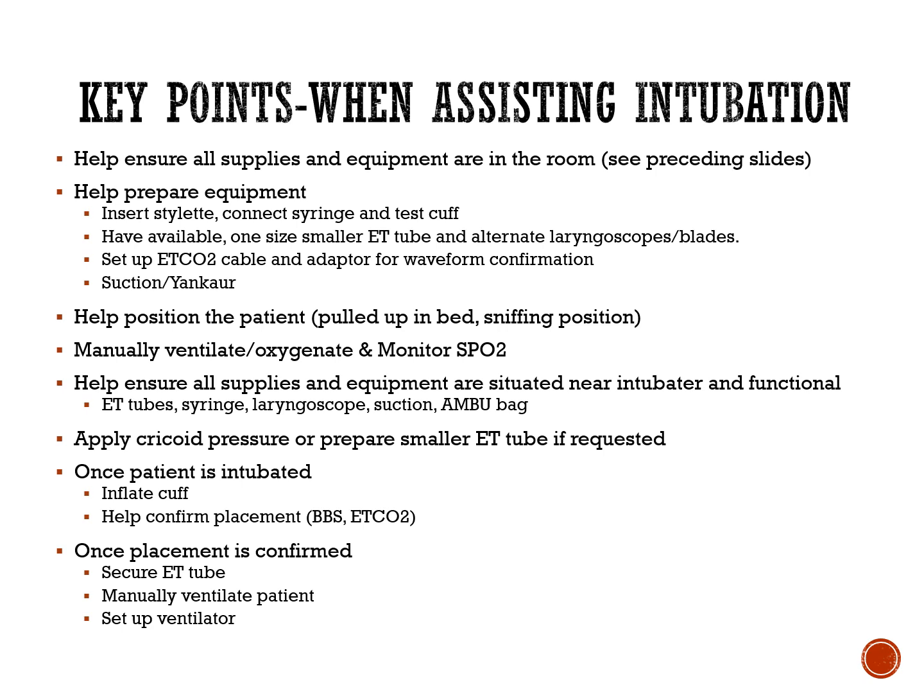So have available one size smaller ET tube, alternative laryngoscope blades. Set up the end-tidal cable and the adapter in advance, assuming you have access to capnography with waveform, suction/Yankauer, and again, I'll add one addendum onto the Yankauer concept as we go through and focus on difficult airway box content. So there's an alternative to the Yankauer, is my point.